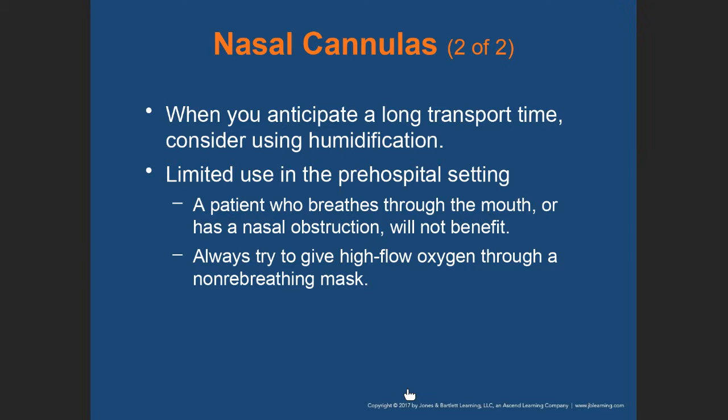The water needs to be changed on every shift, and it's sterile water, right? Sterile water you want to use, or boiled water. Let me not get too technical. So the water needs to be changed, the canister needs to be clean, and when they put more water in it, you don't need to fill it. The minimum level is fine. If it's too close to the maximum, and there's any tilt in the cylinder, the water can get into the line, and that can get into your patient's lungs. We don't want that happening either.